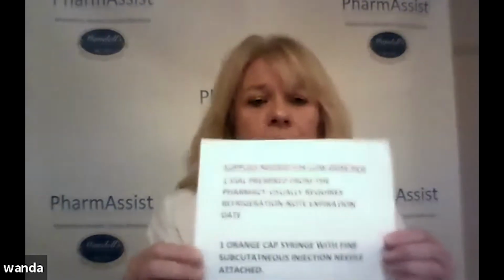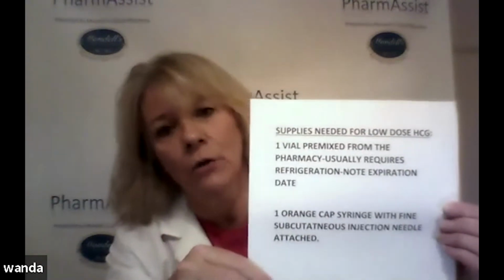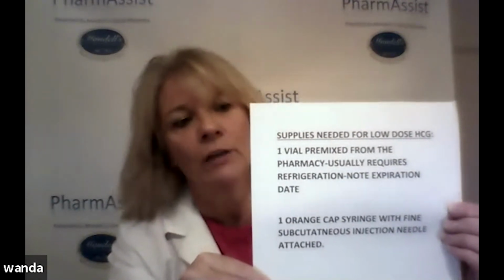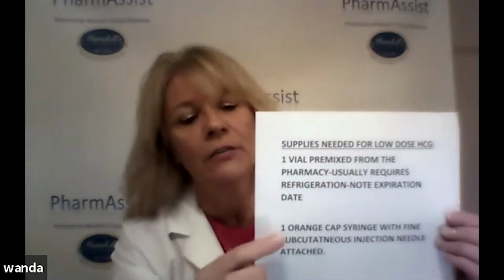The next thing that you will find is you will receive the following supplies from your pharmacy for your low-dose hCG. And I always like to hold this up so you can read it and see it. You will receive 1 vial of pre-mixed low-dose hCG. And from the pharmacy, it might tell you to refrigerate it, as well as there'll be an expiration date there. So you just want to take note of that. The other thing that you'll receive is several orange-tipped or orange-capped needles with syringe. And this is your medication injection needle with syringe for the low-dose hCG.